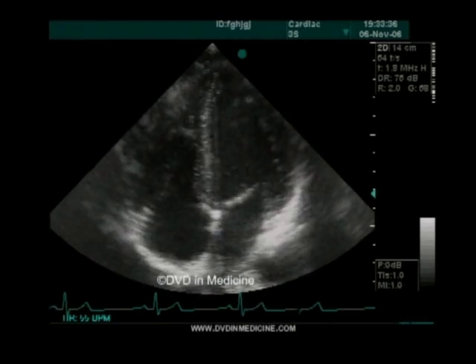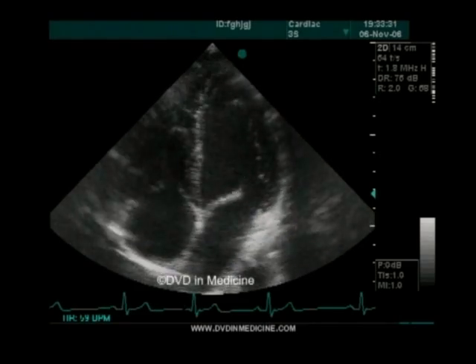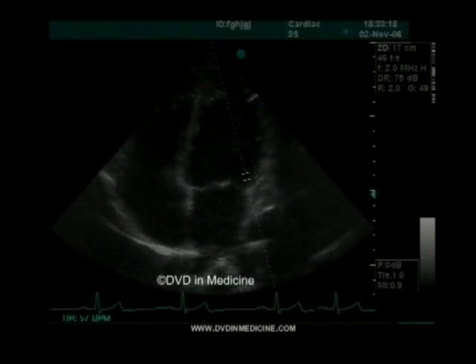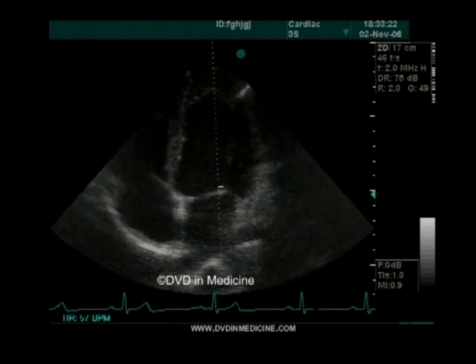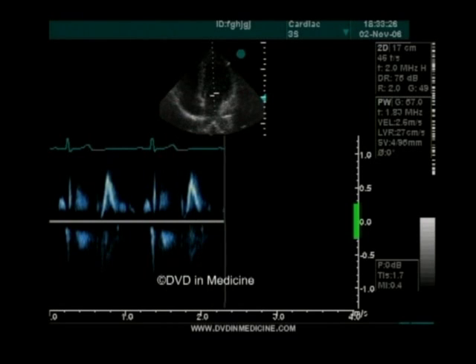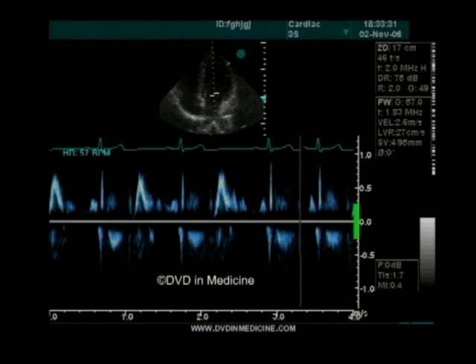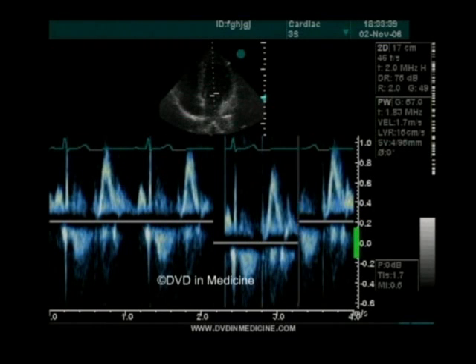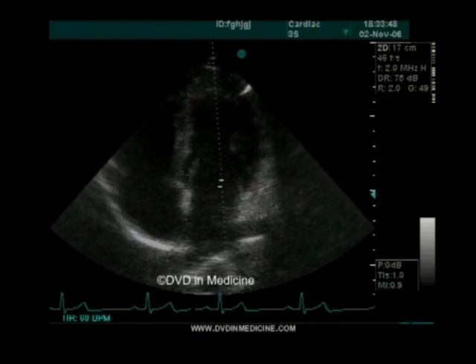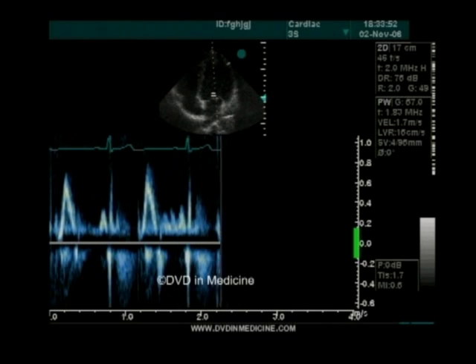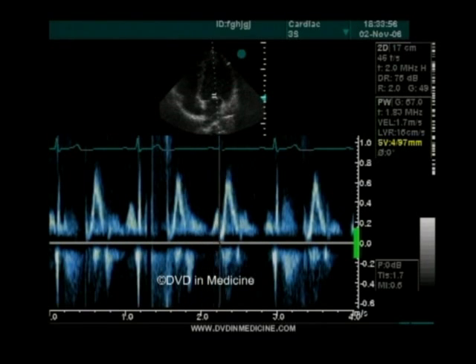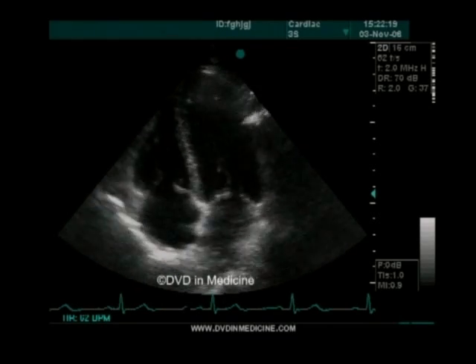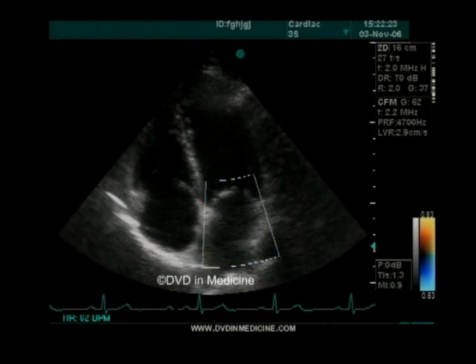During an apical four-chamber examination, one should evaluate whether the left ventricular walls contract uniformly, and also assess the structure and motion of the mitral and tricuspid valves. This approach is ideal for Doppler recordings of blood flow through mitral and tricuspid valves because the Doppler ultrasonic beam is parallel to the direction of blood flow. When performing a Doppler recording of blood flow through the mitral orifice, one should place the sample volume at the tips of the mitral leaflets. This transmitral Doppler waveform allows assessment of left ventricular diastolic function. In the presence of mitral regurgitation, one will register turbulent regurgitant flow in systole.